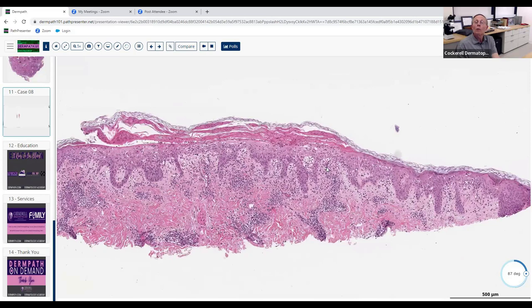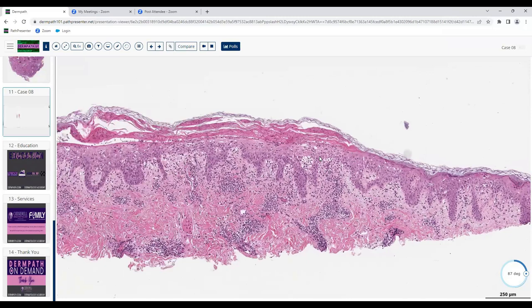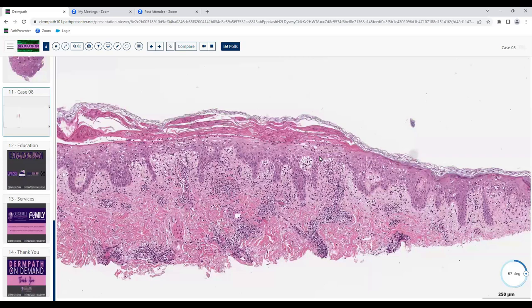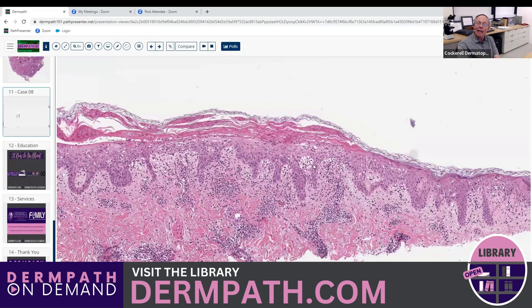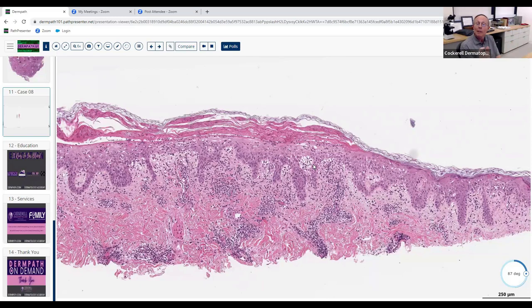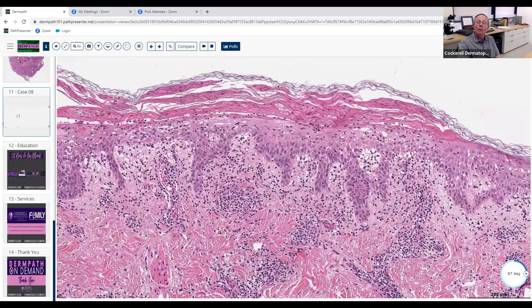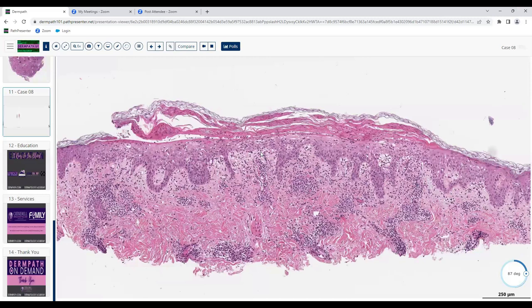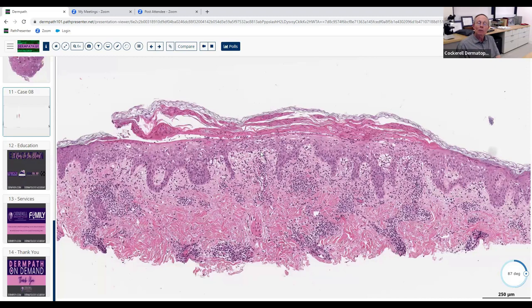Tell us what's wrong with the epidermis. There's some spongiosis, but also little vacuoles and bubbles. Excellent — bubbles equal vacuolar alteration, so there's interface dermatitis. And the cornified layer — is it normal? No — there's parakeratosis with retained nuclei. Is there any distinctive pattern to that parakeratosis?